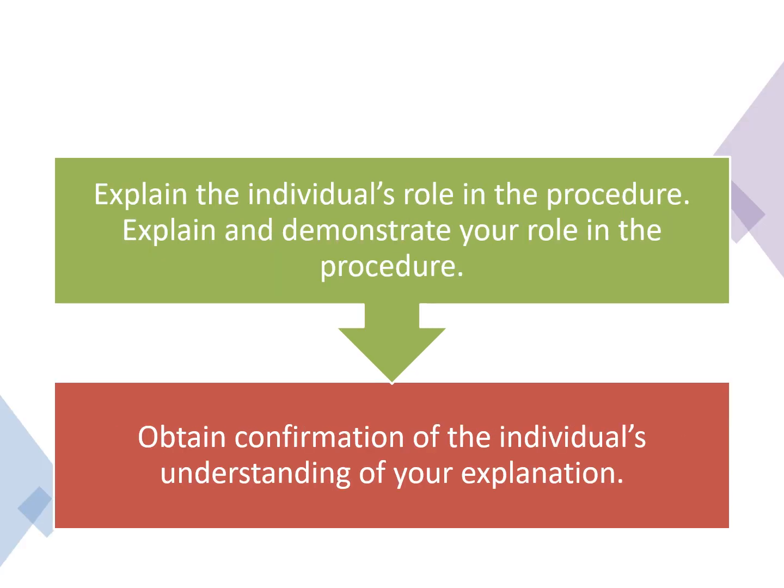After this, you need to explain to the patient the entire procedure. You should explain how you're going to do it. You can probably take one more model, your colleague, where you can demonstrate the procedure so that the patient is comfortable. The patient understands the entire procedure. He'll not be panicky. He'll not be worried. He'll not be irritated. So once he has understood everything, you can definitely expect cooperation from the patient.